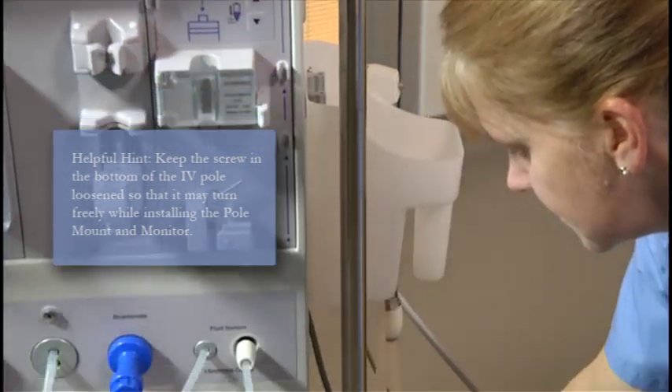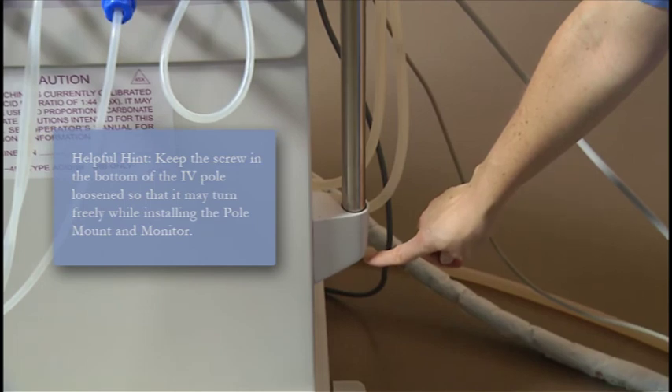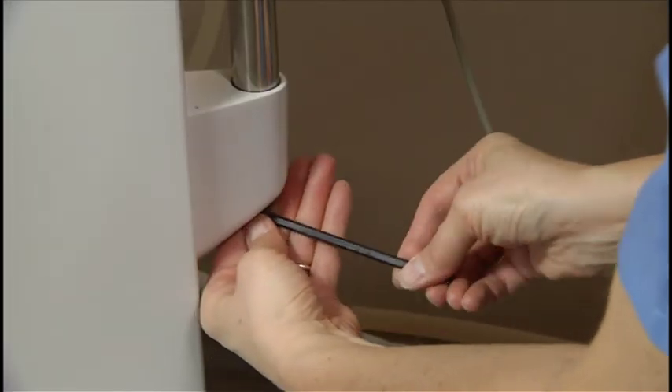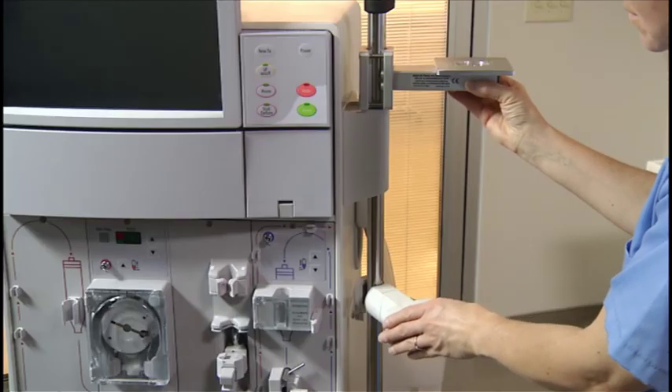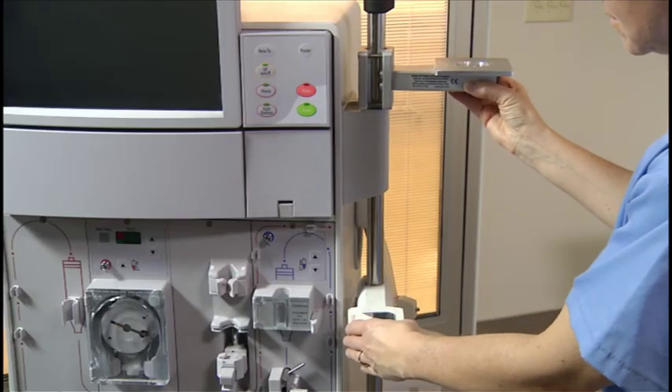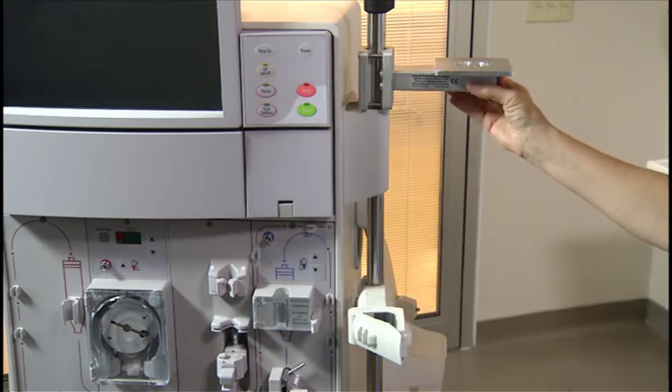It's helpful to keep the screw in the bottom of the IV pole loosened to allow the pole to move freely while installing the pole mount and monitor. Tighten the screw once the monitor and dialyzer holder are aligned properly. Never place the CRITLINE monitor on top of the hemodialysis machine.